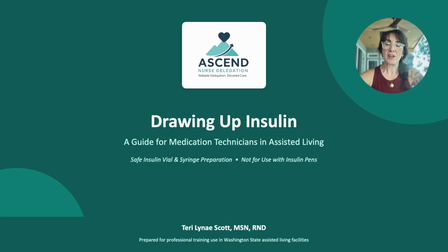This educational video is intended to supplement your hands-on delegation training as a reminder of the steps necessary to draw up insulin from a vial. This is not meant to diagnose or treat. This is for educational purposes only.